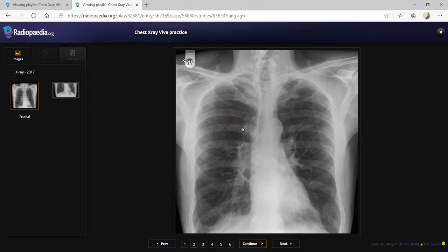Okay, correct. But I can see the hilum through this opacity, so it appears that it is overlying a deep shadow. I'm going through the bones. There is a hilar... What is your inference about that lesion? So I think this is likely to be a hilar mass, or it could be related to a hilar tumor or middle mediastinal mass. So further evaluation with CT or cross-sectional imaging would be appropriate, after correlation with the previous chest x-rays.